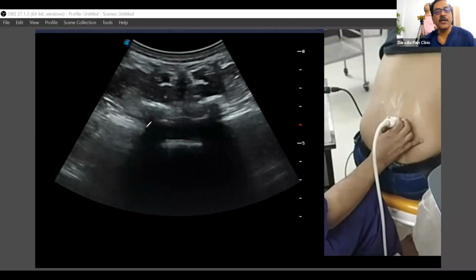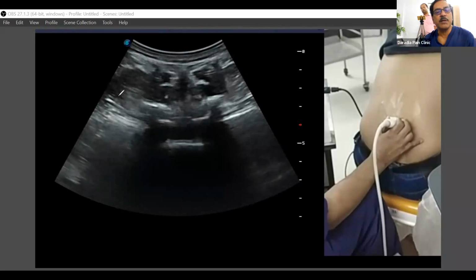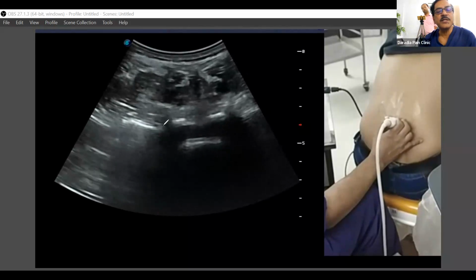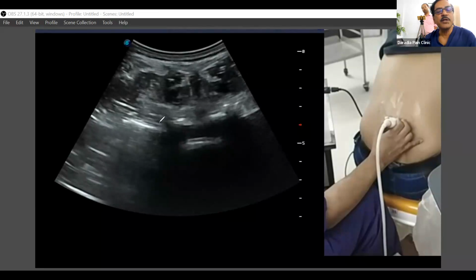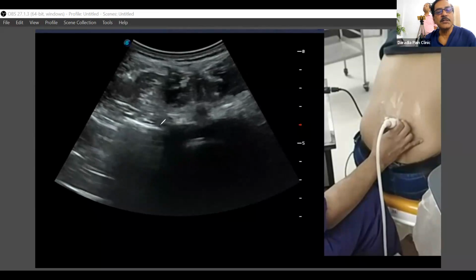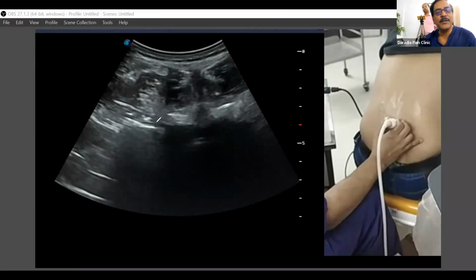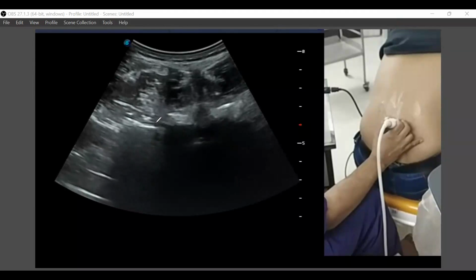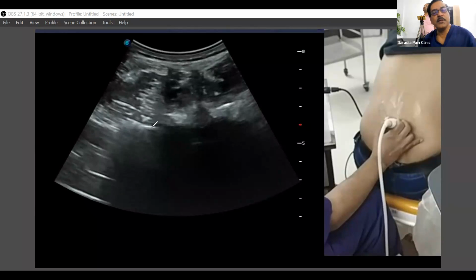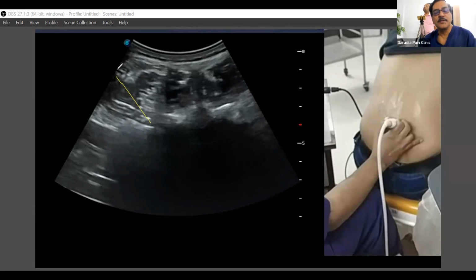Here we'll try to find out, if you're doing the medial branch block, the needle should be coming here. This is your transverse process, and now see very nicely the pulsations. Everybody can appreciate that. Can you appreciate the dancing arteries? Say yes. Just in front of my pen, over the transverse process. Can you see the pulsation? Yes. And just beside that is your nerve. So if you wish to do the medial branch block, your needle should be coming like this, in-plane approach.